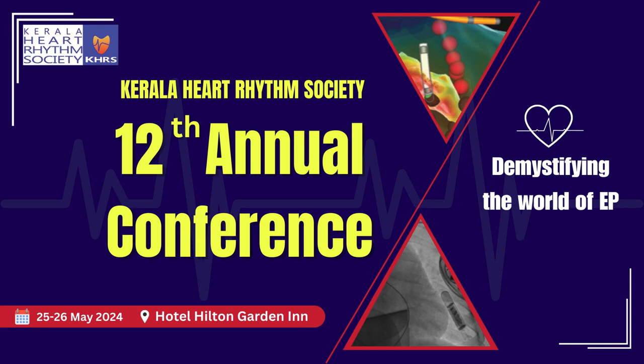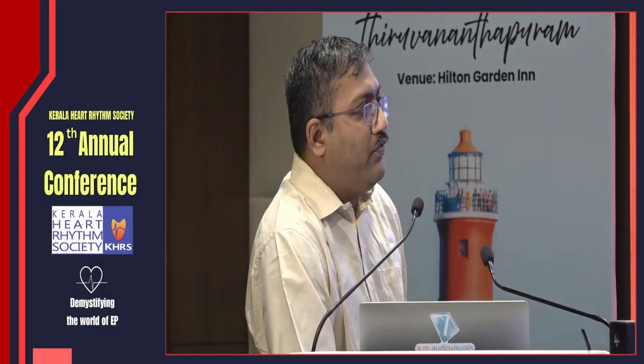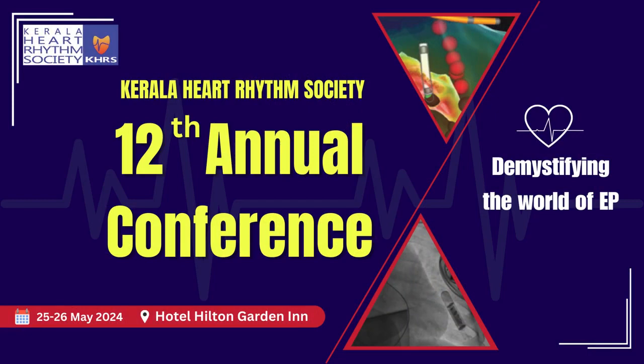On wearable devices, if AF is detected, how to follow up, any guidelines? Because we have so many wearable devices like watches and all. No, there are no guidelines on follow-up. Most of the studies have followed up continuously, because it's a device, for about 6 months.